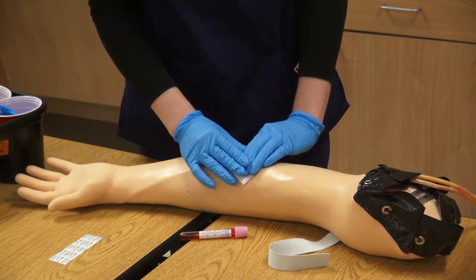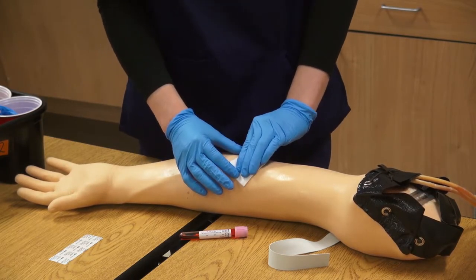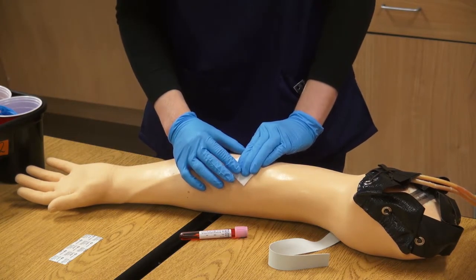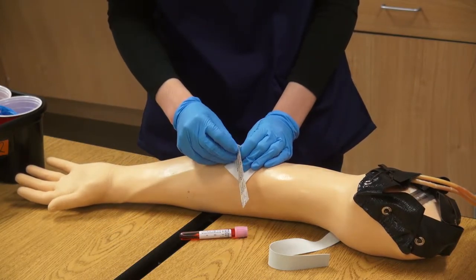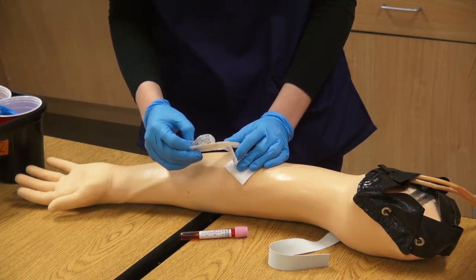Continue to apply pressure to the site until bleeding has stopped. This should take several minutes. Failure to do so will result in hematomas. After holding pressure, apply a band-aid or self-adhering wrap to the site so that pressure is continued for a longer amount of time.